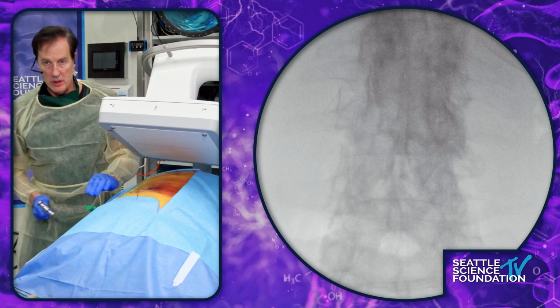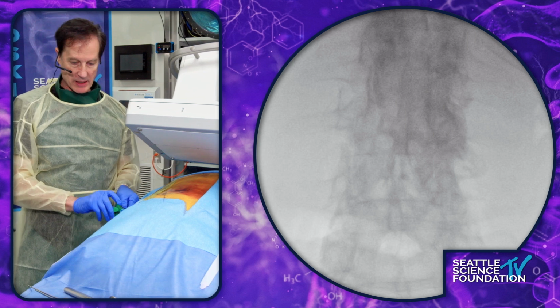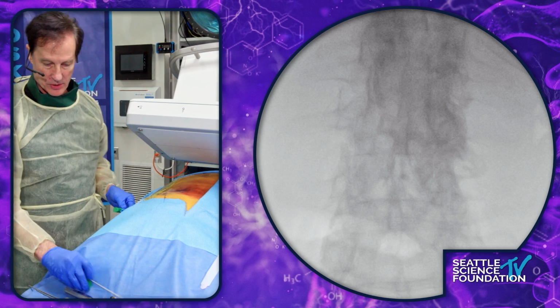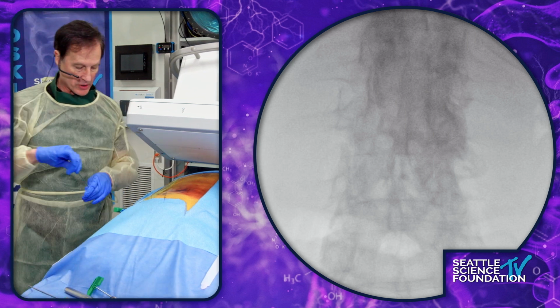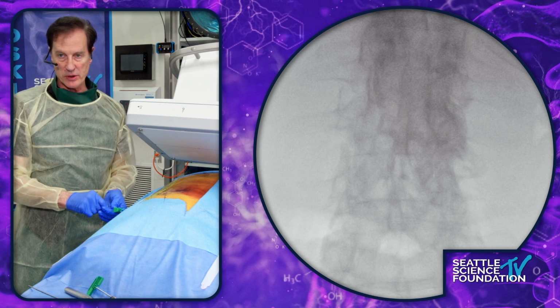So picture, we crossed into the sacral ala. I'm going to take this and put the Steinmann pin through this. This is an 8-gauge non-tapered Jamshidi needle, picture.